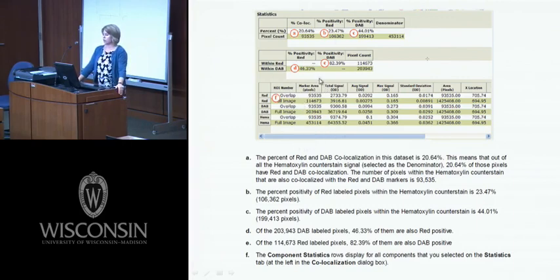It will give you a marker area. So if you select your region of interest versus the whole image, it will tell you how many pixels. In the case of a chromogen, it will tell you the optical density. The total signal is printed out here. It will give you an average signal, the max signal, the standard deviation, etc.